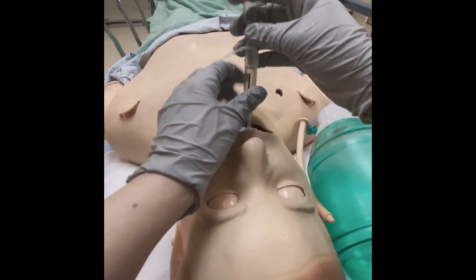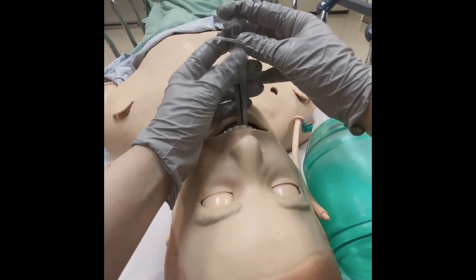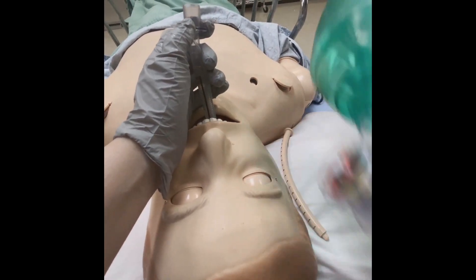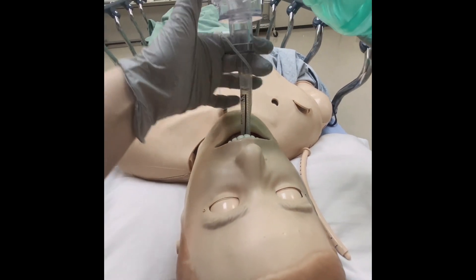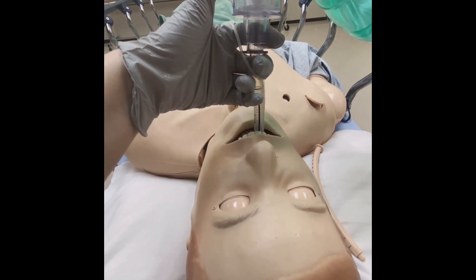Now, reattach your BVM connector device and reconfirm placement of your ET tube with end tidal CO2 or by looking for chest rise.